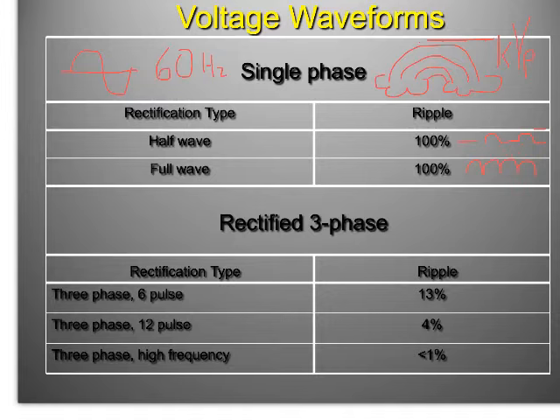Okay? So the way that we're going to fix that is rectify the pulses. And this is illustrated very clearly on figure 8.10 and figure 8.11 in our textbook. So for 3-phase, 6-pulse, what's actually occurring is very clearly illustrated on figure 8.11.